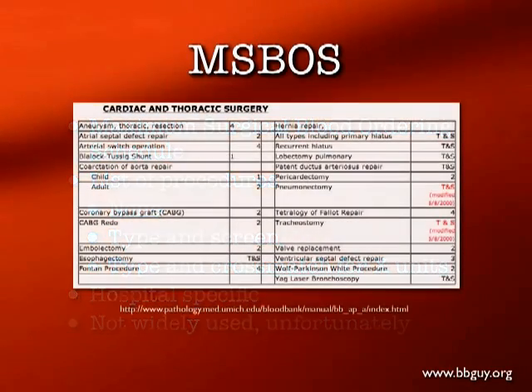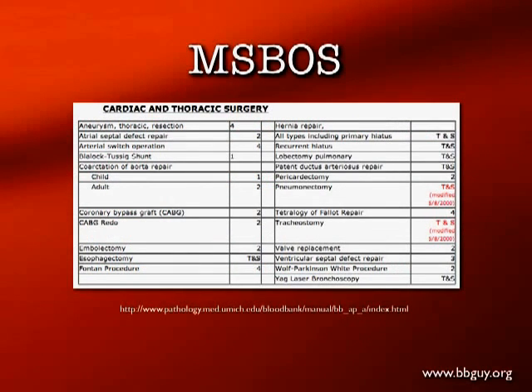This is an example of one part of the MSBOS from the University of Michigan that they published online. Thank you to them, specifically for cardiovascular surgery, where it talks about, for example, at the top left, aneurysm, thoracic resection, type and cross for 4 units. You see on the right some procedures that would be type and screens. And in other parts of the MSBOS, you would see things that you wouldn't need a sample whatsoever.